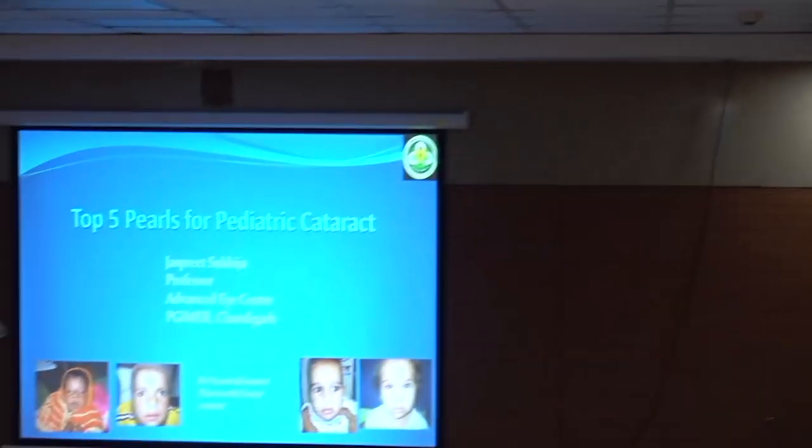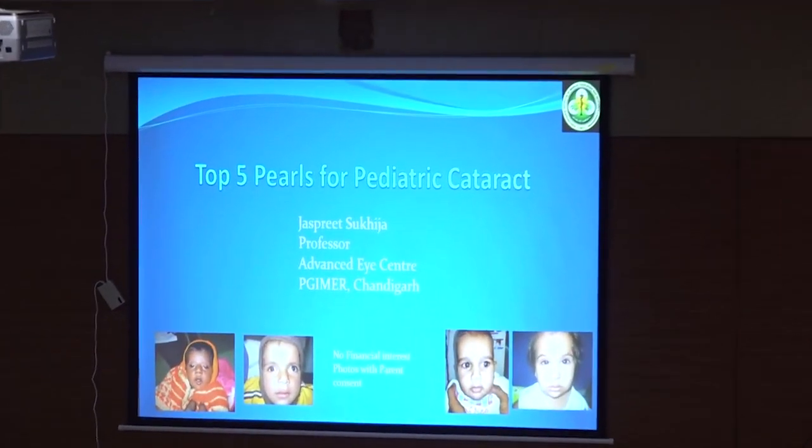Thank you, Dr. Suresh, and of course it's a collaborative effort of NZOS and COS. So I won't take much time, and of course you had such a wonderful talk on cataract surgery and how to go about it, and Dr. Gagan is also a prolific pediatric cataract surgeon as well. So these pediatric cataracts are not hard in most of the cases. They are quite soft, so you just need an irrigation aspiration.